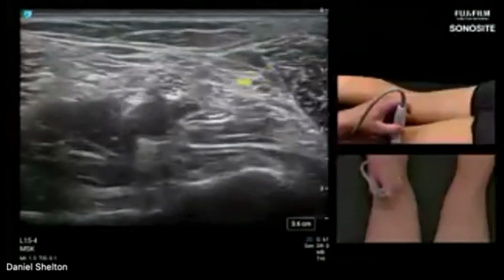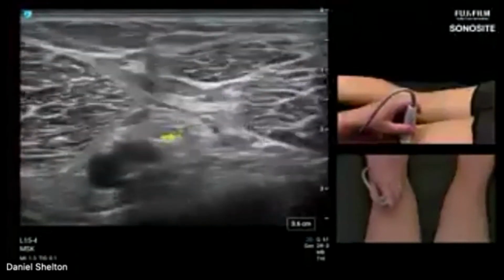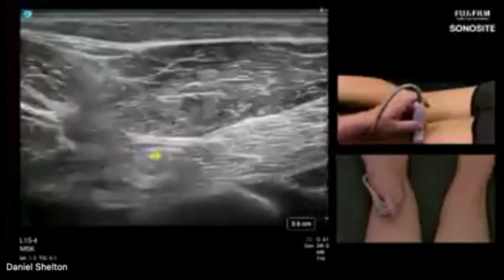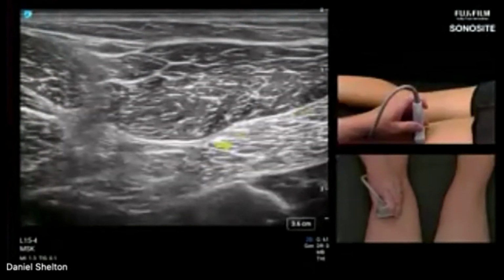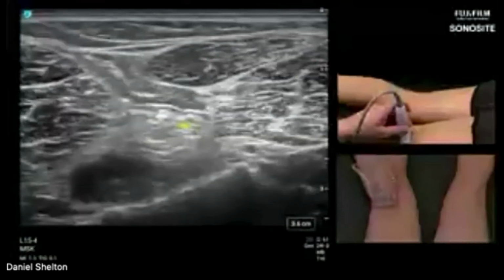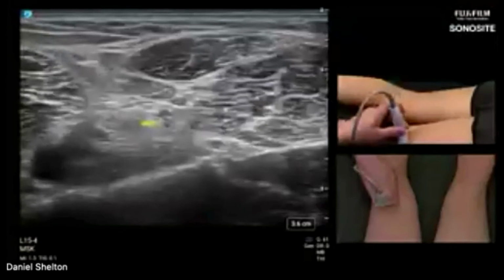You can already see the peroneal nerve coming to join up with the distal sciatic. So here's the sciatic nerve as one here. Here's the biceps femoris again, just lateral to it. So biceps femoris. Here's that bifurcation. Here, you can see those two split off from each other really nicely, very easy to see.